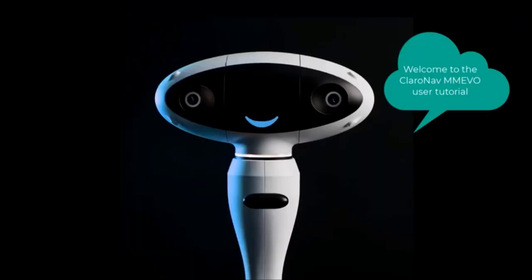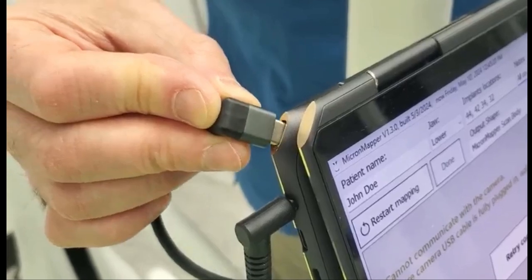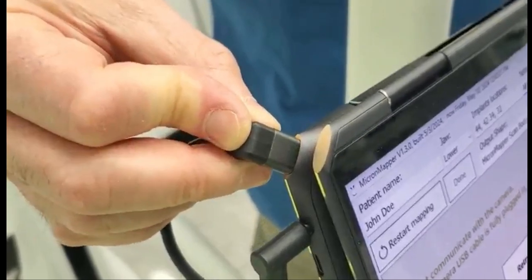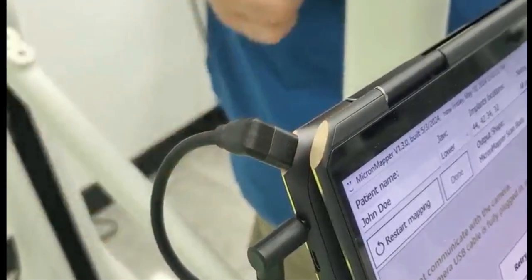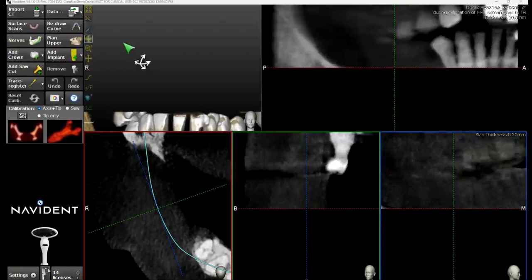In this step-by-step video, we will review and explain the workflow with MicronMapper EVO. To start, connect the Navident MT4 camera and open the MicronMapper application.